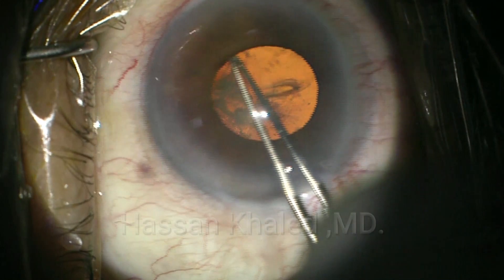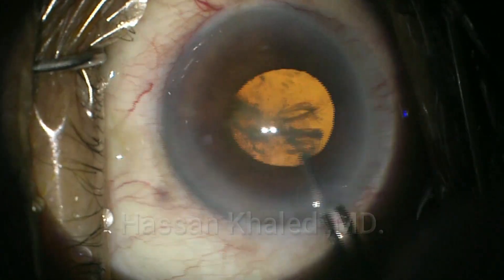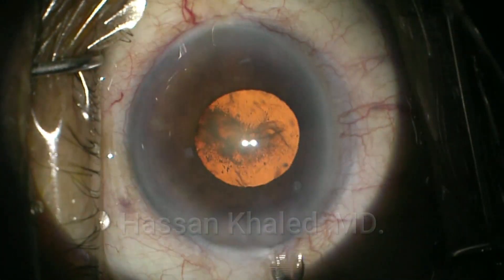Here is the capsulorhexis. You can see the edge of the capsulorhexis is behind the iris — it is larger than the diameter of the pupil.